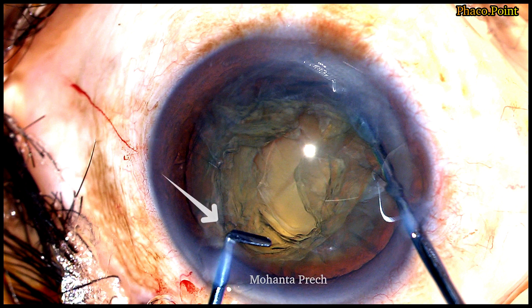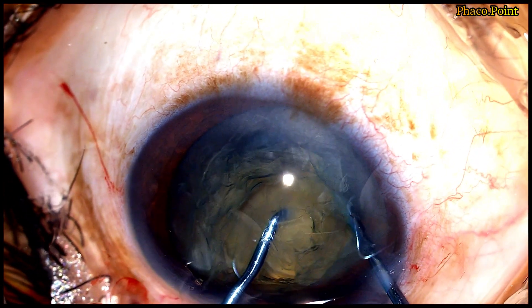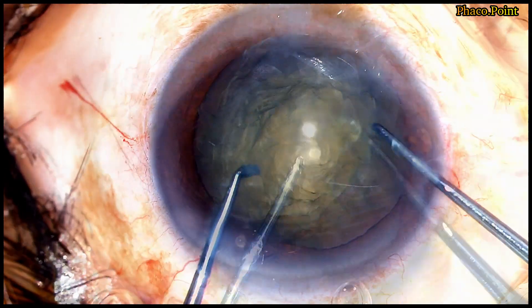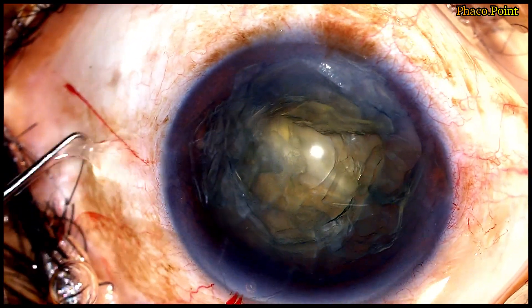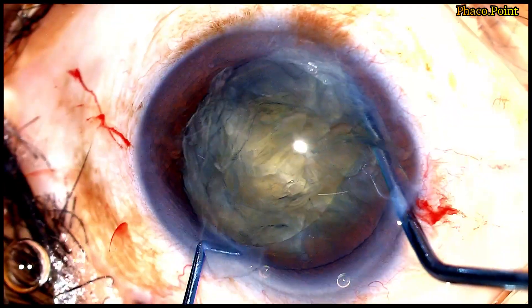The instrument on the left is the Mohanta pre-chopper. It has a sharp anterior edge and is approximately two millimeters long. The tip of the pre-chopper engages into the nucleus at a point exactly opposite the sustainer. The pre-chopper is then buried into the substance of the nucleus and both instruments are drawn towards each other, after which they are separated laterally, resulting in the successful division of the nucleus into two hemi nuclei. This is followed by rotation of the nucleus and the same pre-chopper is used in the exact same manner to further subdivide the hemi nucleus into two smaller fragments.